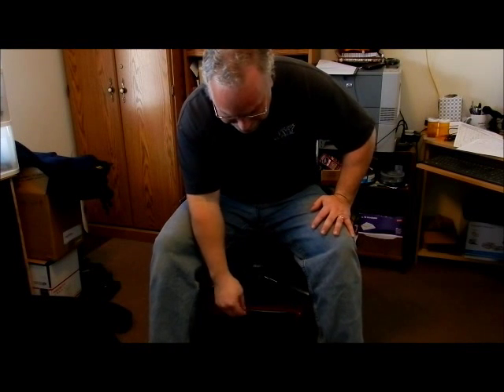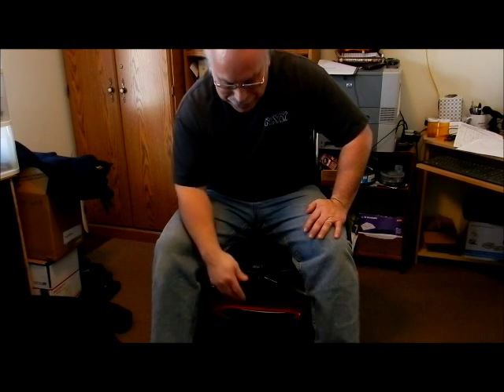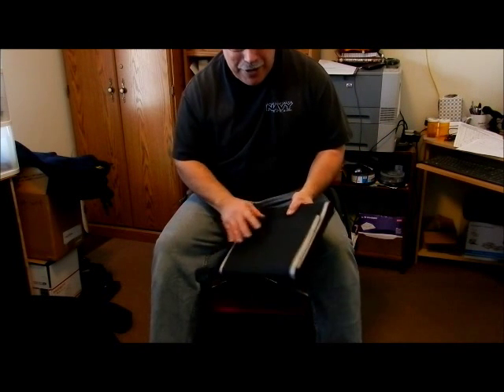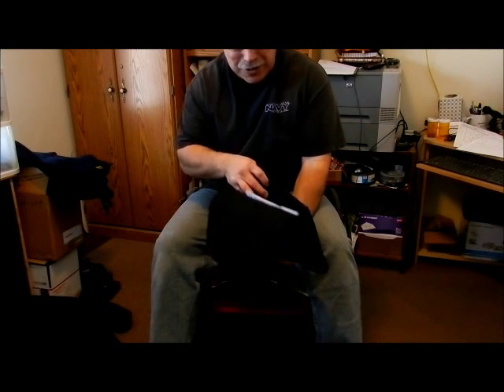Hey guys, check this out. The little pouch I put underneath here didn't cost me $30 like on eBay. It's all homemade, from donated items from college and stuff. So look at this. If I had a tablet in this or even a small laptop, it works good.